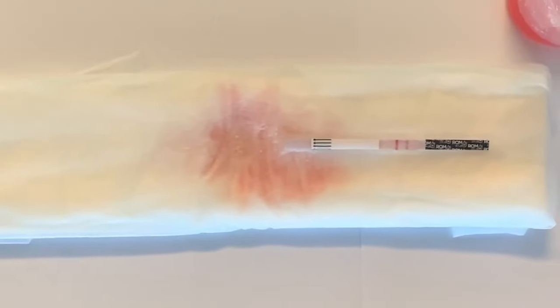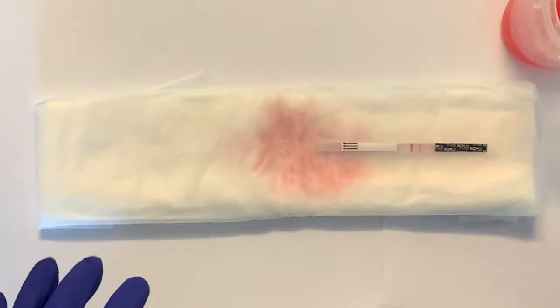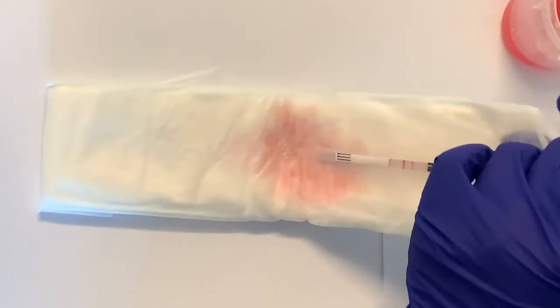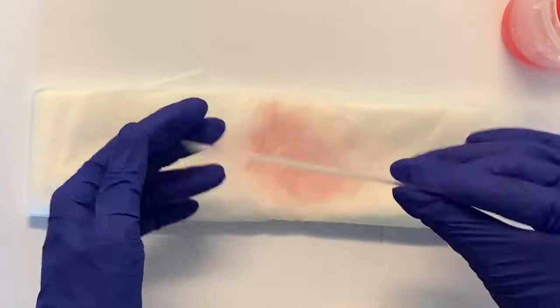If two purple bars appear, as shown here, the leakage of fluid is likely to be amniotic fluid. If only one bar appears, this means that the leakage could be urine, normal vaginal discharge, or semen.